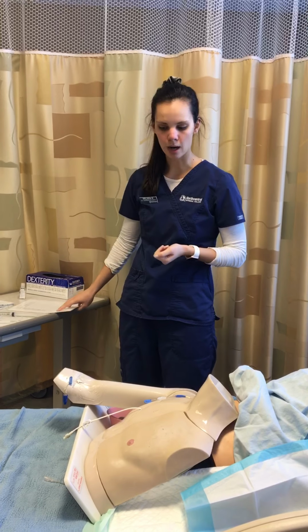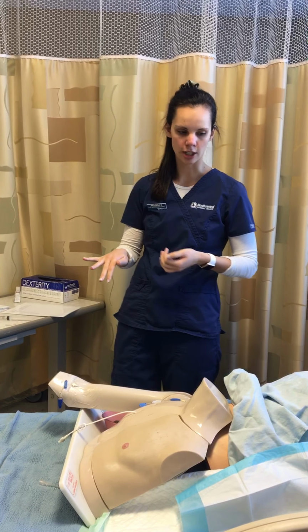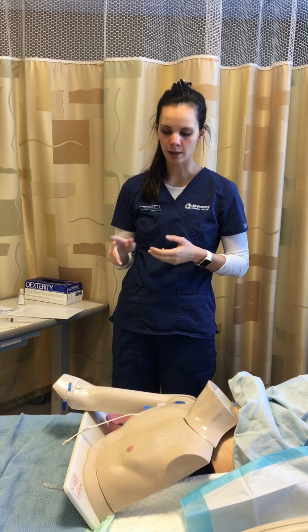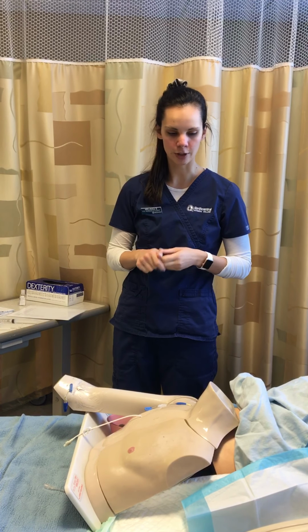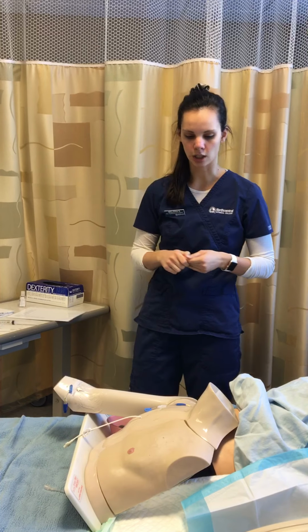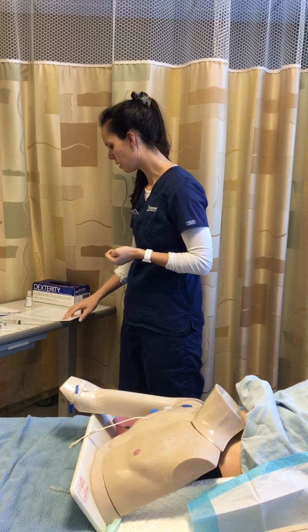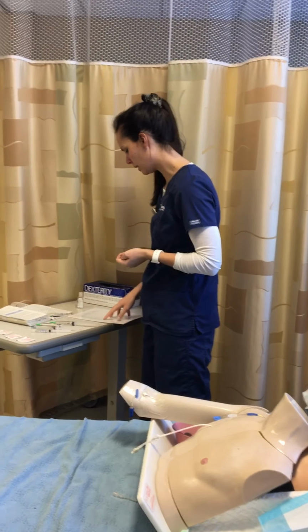I also looked in your MAR and you have a PICC line dressing change due as well, but we'll give you the Zofran through your PICC line first, and then we'll change your dressing. Alright, so I'm going to get my med ready here.